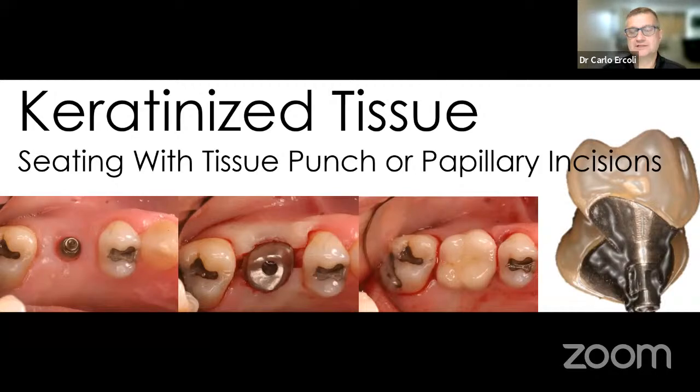and actually it becomes very hard to seat. I've seen many times dentists, including some of our residents, trying to mold the shape of the tissue with a temporary restoration. In this area, really in the posterior area, there is no need to do so. It is very simple, very easy. Just make a very simple incision, as you can see here in the papilla, in the posterior area, and slightly move that tissue.